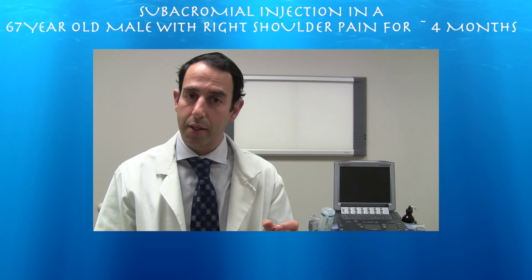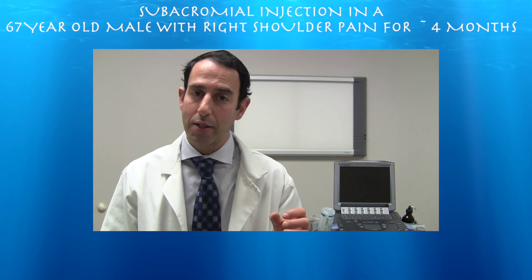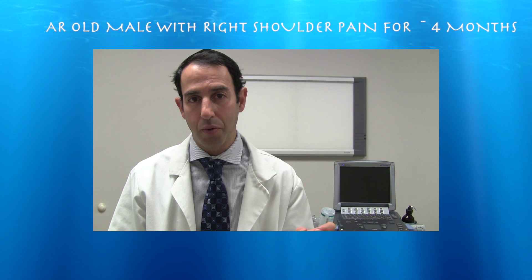Once your needle is in, you can actually see your needle better, and if you want, you can advance your needle proximally up through the subdeltoid bursa.